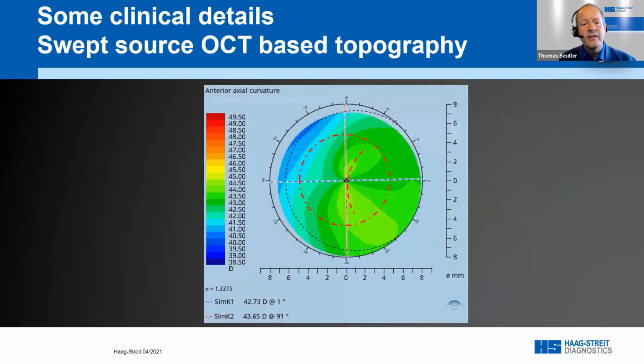So if you look at it, I introduced here a circular line for 5 millimeters. So that's basically the optics of an IOL. And we see that the whole thing is still a little bit bent, but not too much. So we see, if this patient insists on a toric, we might have to talk. Now, we can have a further look.